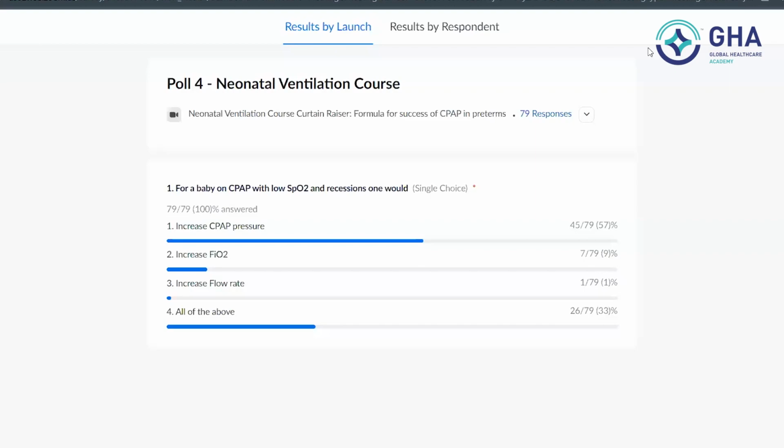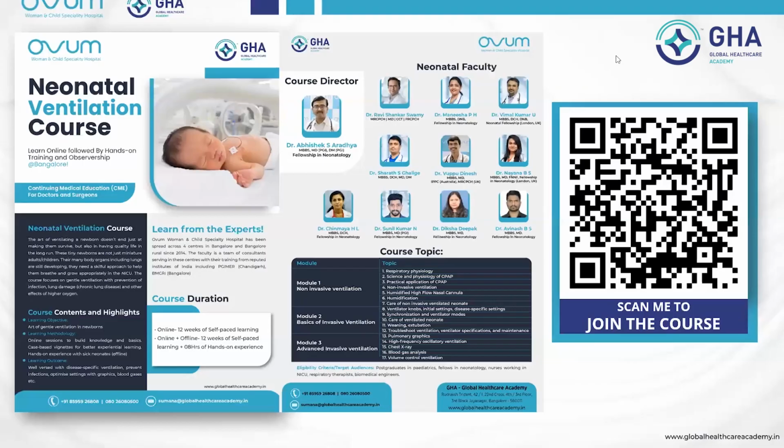So the question is by Gayatri. She's asking that humidifiers normally have an invasive and non-invasive mode. So we discussed that in preterm we need to use an invasive mode. So she had doubts on that. So whatever be the respiratory support in newborns, whether it is preterm or term baby, current consensus is we have to use invasive mode of humidification.